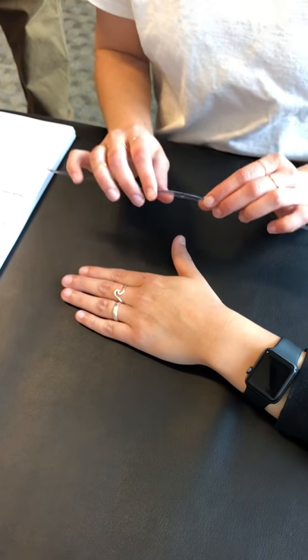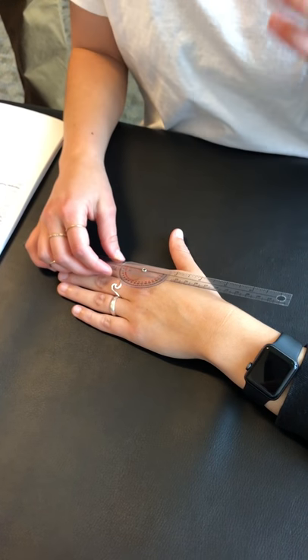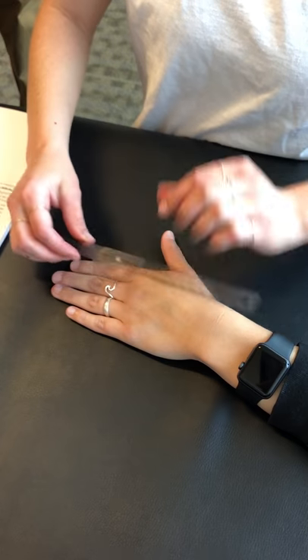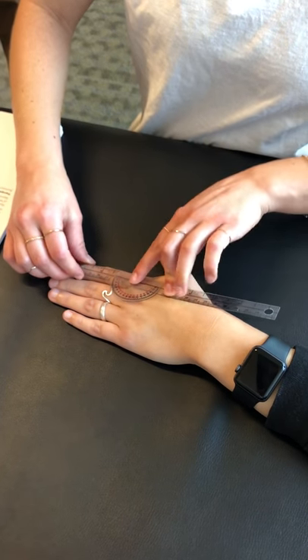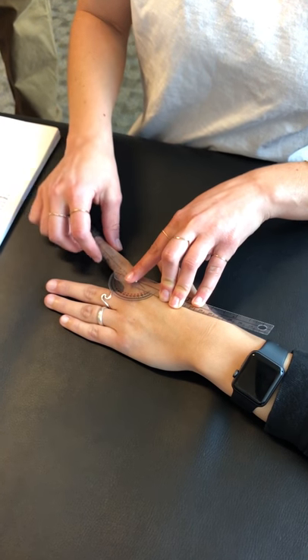This is MCP abduction for goniometry. It is a soft end-feel and the normal range is 0 to 20 degrees. I'm going to line the fulcrum up right here and then press her finger out as much as she can go and bring that arm.